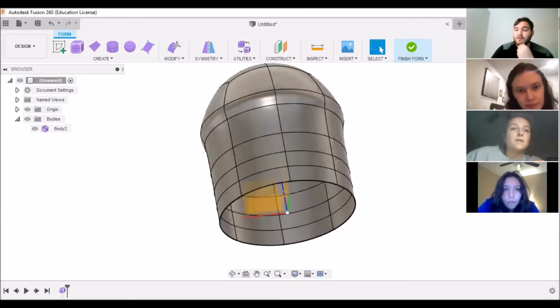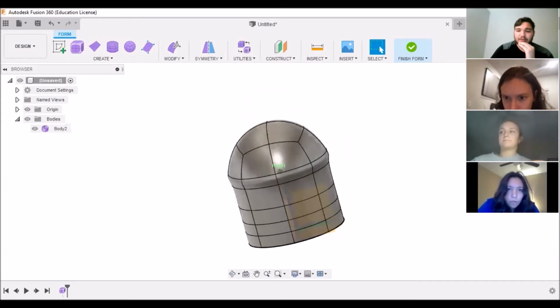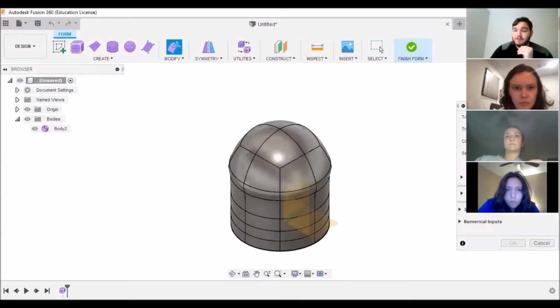And you can do that for any type of form that you want. There will be issues with making sure the correct number of segments line up. But for now, with quad ball and cylinder, that should be fine. Okay, so cool. Now we have something funky. We can go back to Edit Form on the Modify tab. And this is where it gets super versatile.